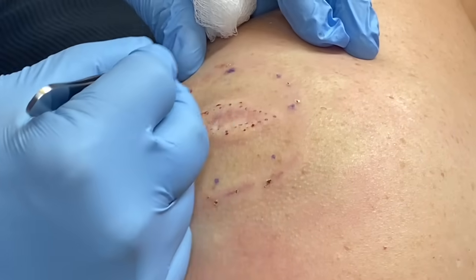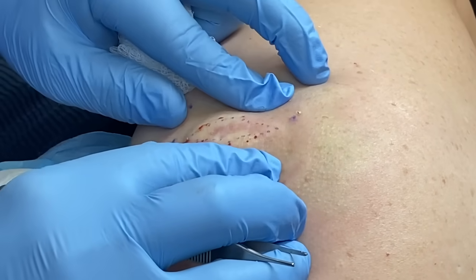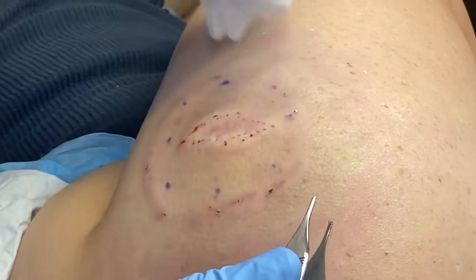So we've done a circumferential block through here with lidocaine. We're working with Dr. Laser again today, but he's got some laryngitis, so we'll be asking minimum questions. So why am I dissecting in this plane? What are those lines that I follow? Langer's lines.